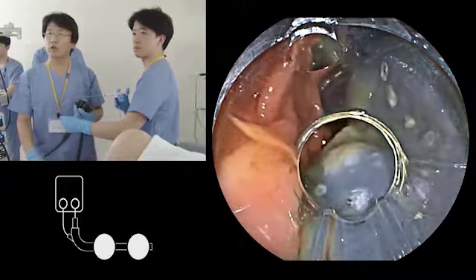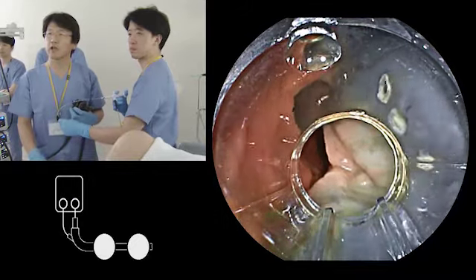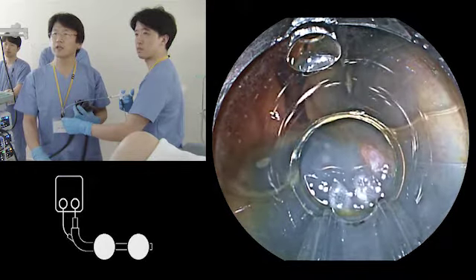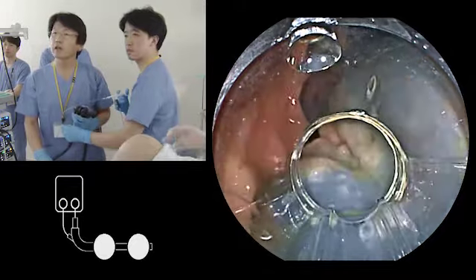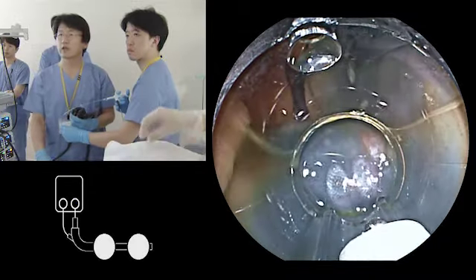Okay, I will explain how to perform the pocket creation method. This is the lesion and this is the marking I placed. So I make about 2 centimeters opening of the pocket. The distance is good enough, so I will make a cut on the mark in this case, okay?